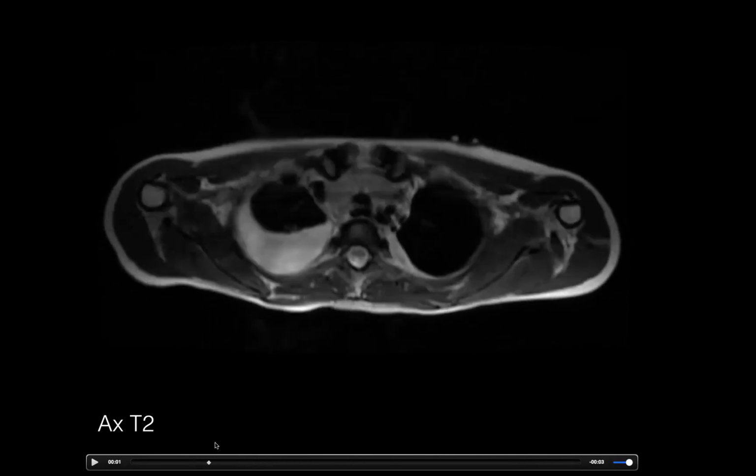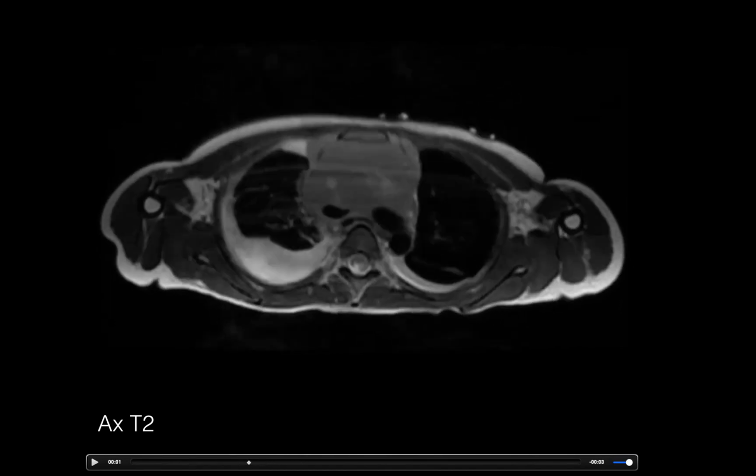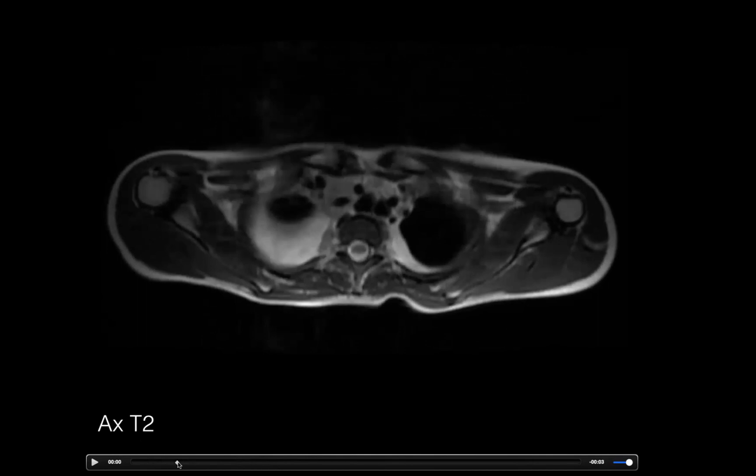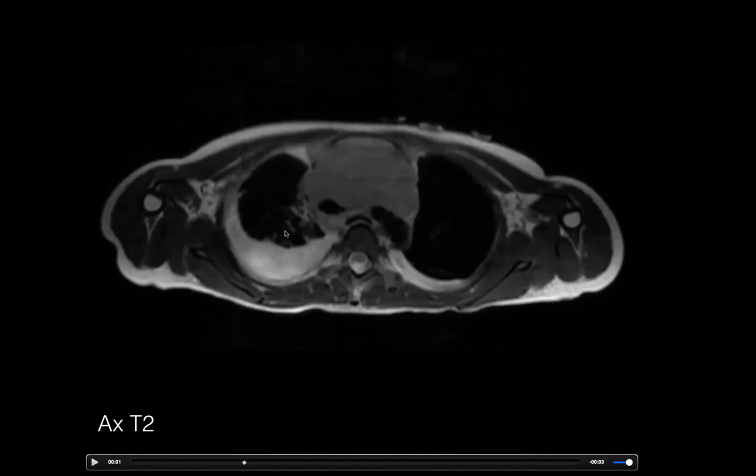There was one other thing to show. If you notice here, this is the airway. This is the trachea. Watch as I go down, watch what happens to this trachea. You see how it's now squashed. So the mass is there.